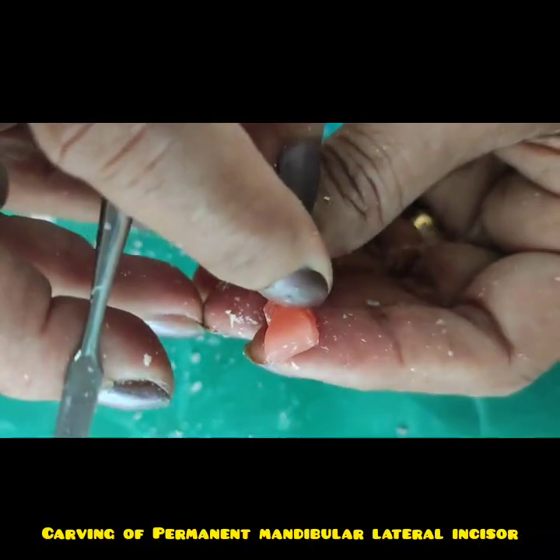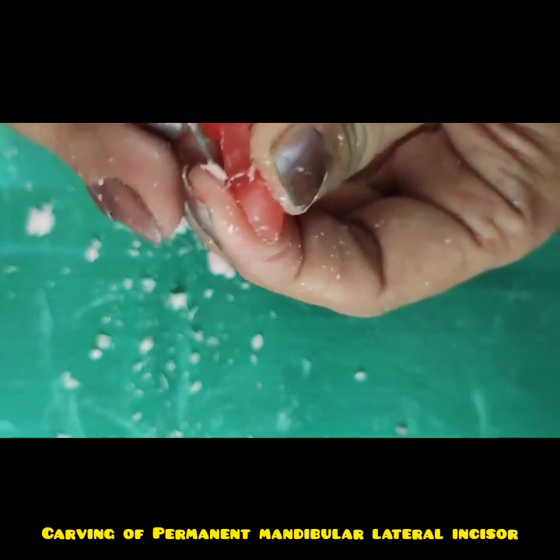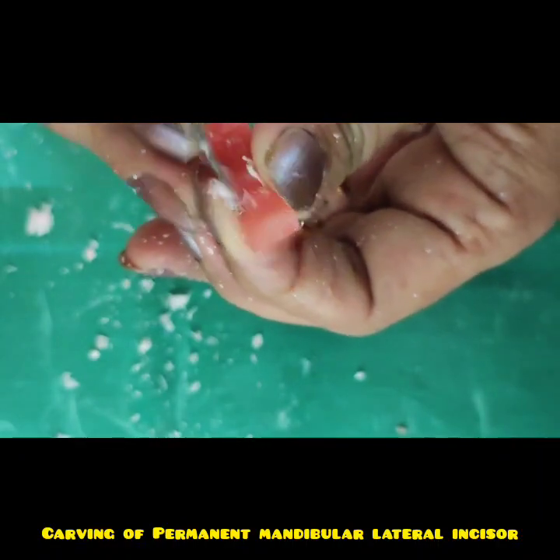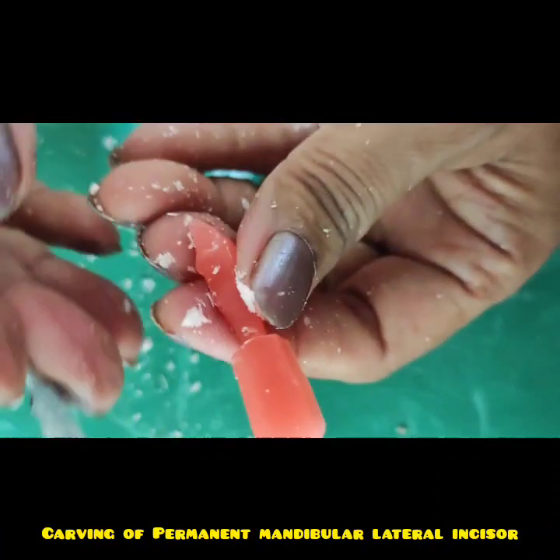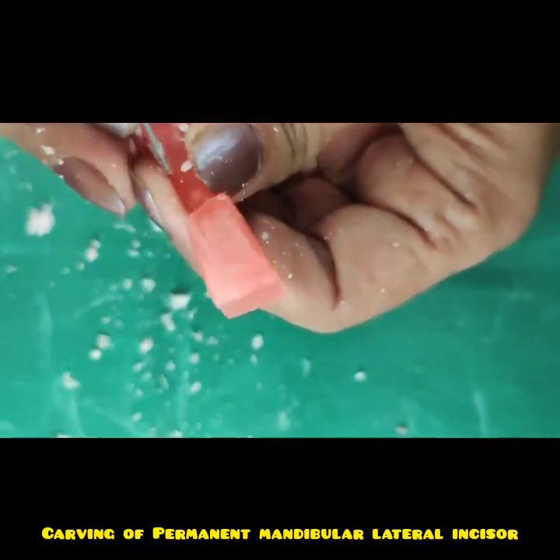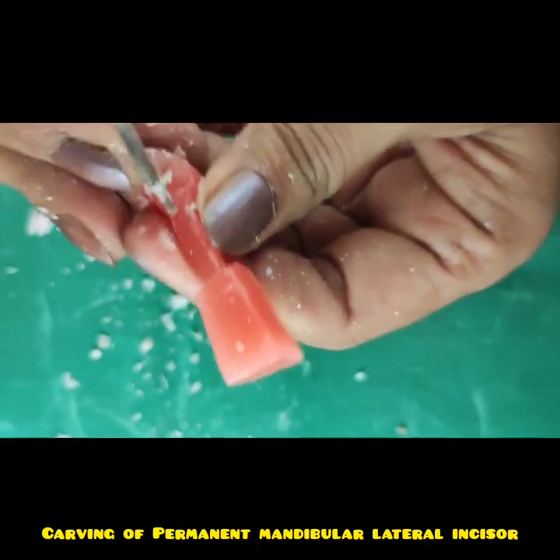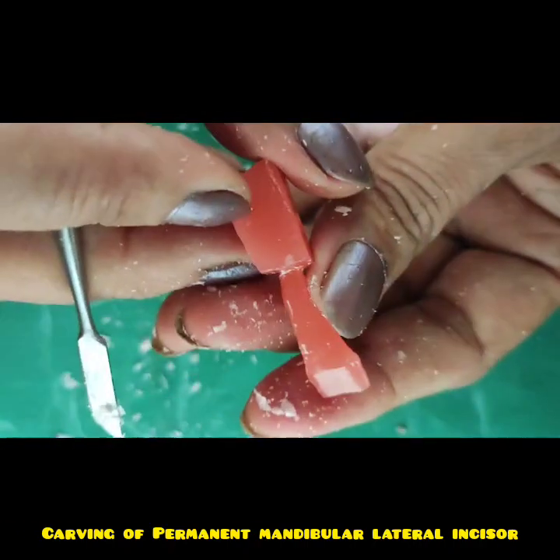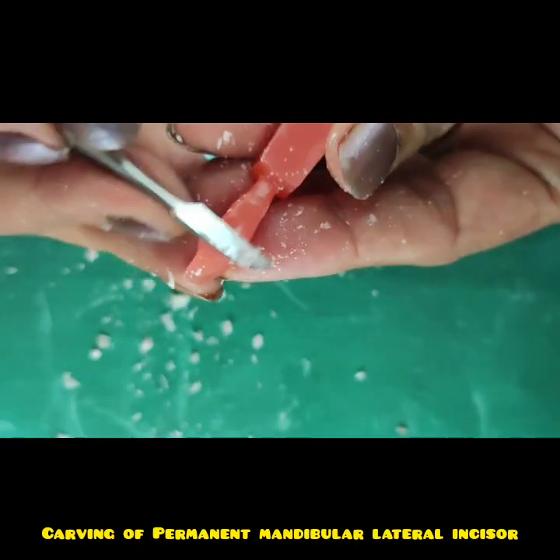Okay, so after reduction you can see there is a step of wax. So we need to reduce till the crown and root surfaces are in the same plane. There shouldn't be any step at the cervical line. So reduce and merge both the crown and root surfaces, and your root also should be converging towards the center of the lingual surface. It should not be squarish, it should be a rounded triangle, like this towards the cingulum, and the root should be tapering.